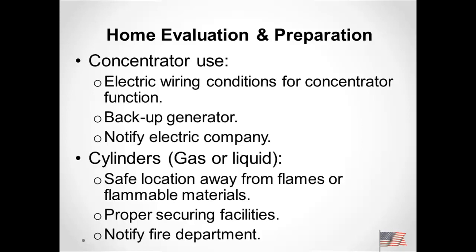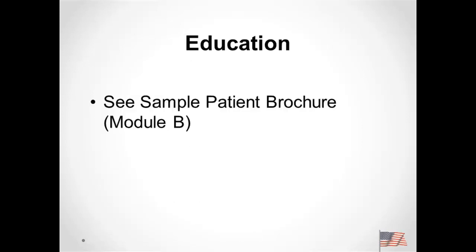electrical outlets? Are they grounded outlets? If they don't have a backup generator, we'll need to notify the electrical company. We need to actually do it either way. If they're using cylinders, either gas or liquid, there needs to be a safe spot. We talked about proper securing of cylinders specifically, and we'll also notify the fire department also.